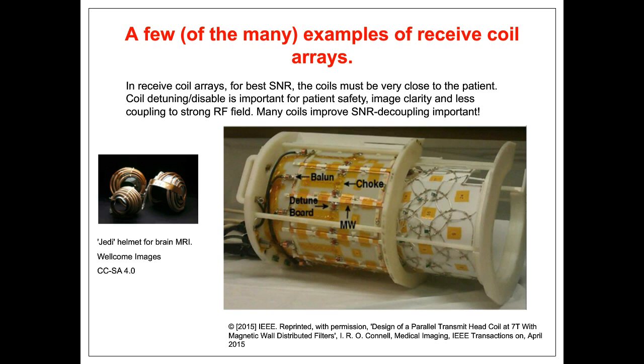Both the transmitter and receiver are tuned to the same frequency, and the patient's head is inside a centimeter or two away from those coils. So if you have two independent coils and you bring them close together, through mutual coupling they could start interacting with each other. You certainly don't want those receive coils to pick up the RF signal when it transmits.